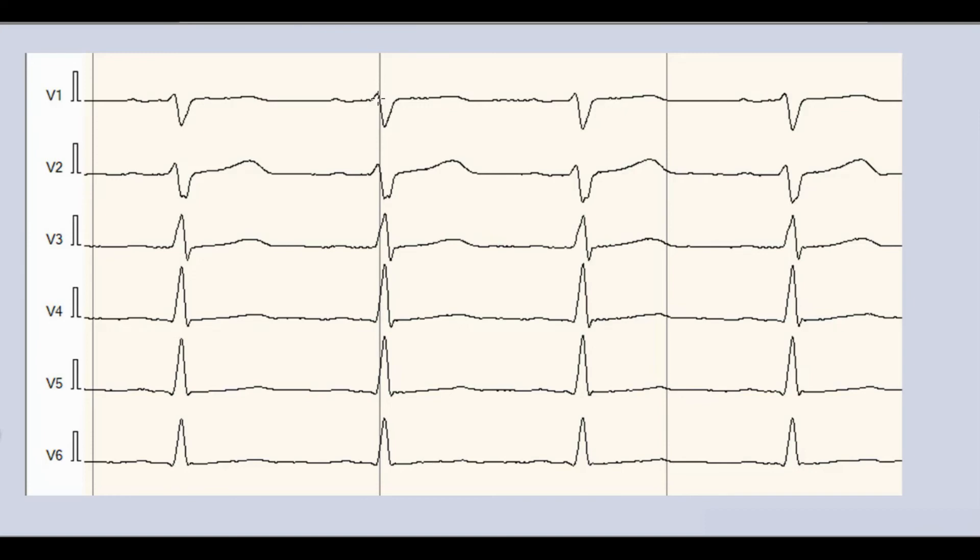In chest leads, S wave should gradually decrease in amplitude from V1 to V4 and has minimal amplitude in V5 and V6.